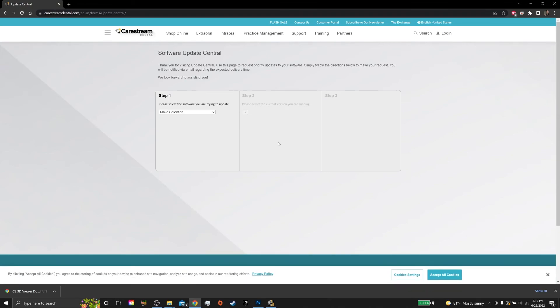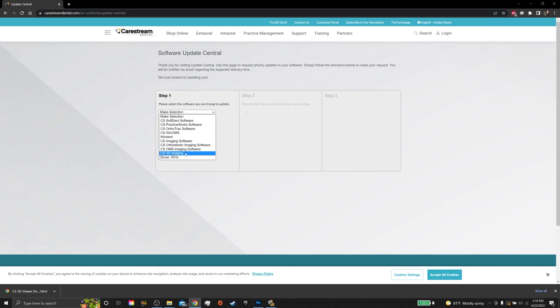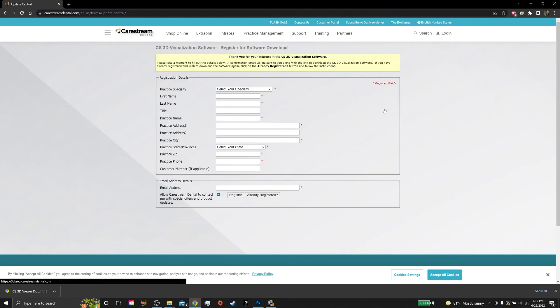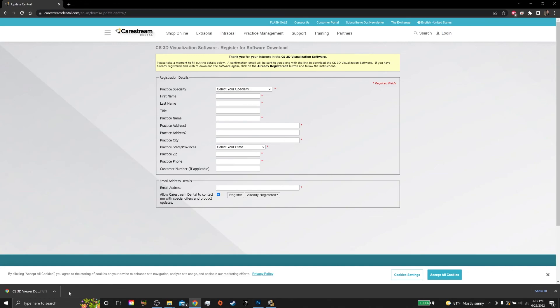Once you're in Update Central, in step one, select CS3D Imaging V3.X, and then click here to download a full version of the software. You'll have to input some information here, but once you do, you'll get a full version of the 3D viewing software in your downloads folder.